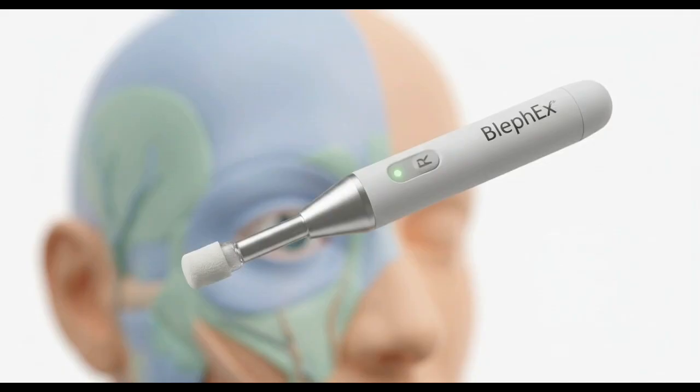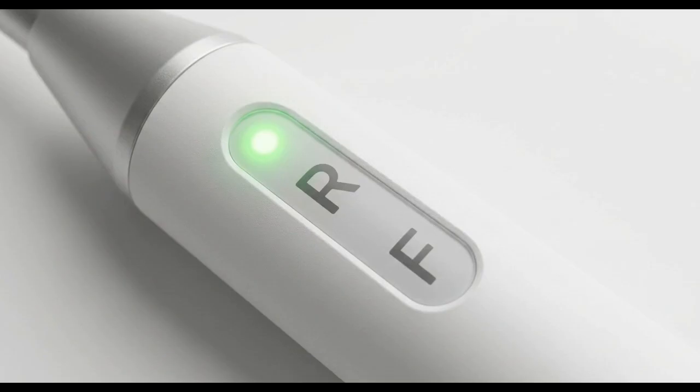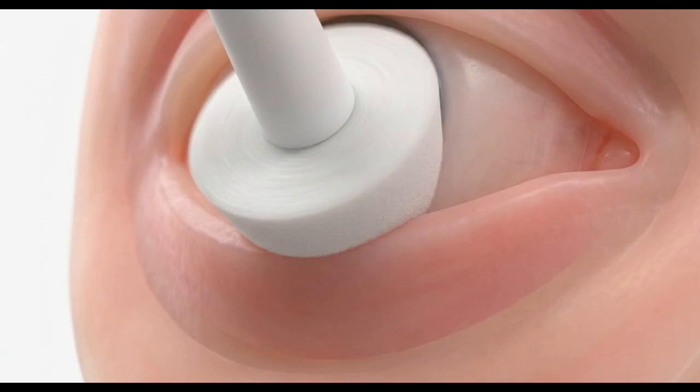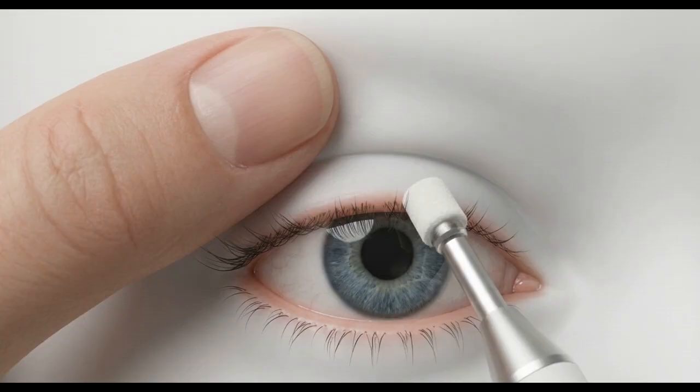Pause at the midpoint of the treatment. Press the power button once to reverse the microsponge's direction of spin. Verify the direction change by confirming that the R LED is lit on the handpiece. Then repeat the 20 to 30 second treatment pass on the exact same lower lid. To adapt this protocol for the upper lid, instruct the patient to look down. Gently pull the upper lid upward and repeat the dual direction passes along the upper margin.